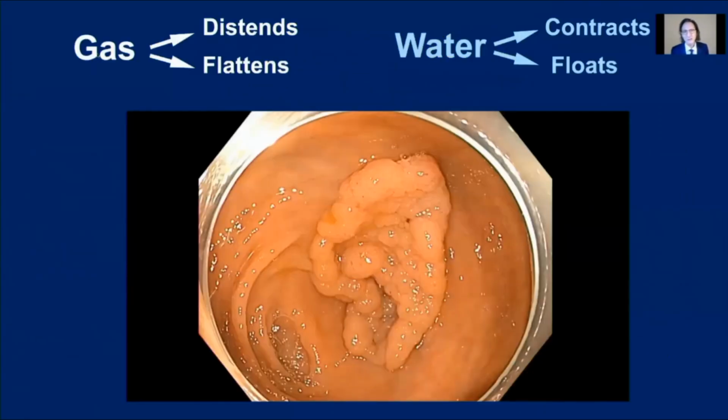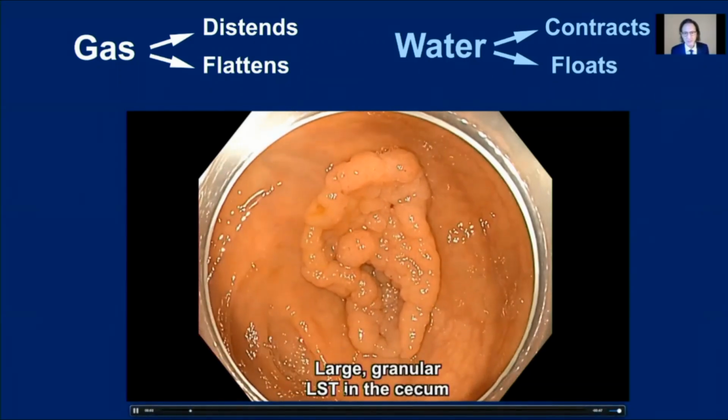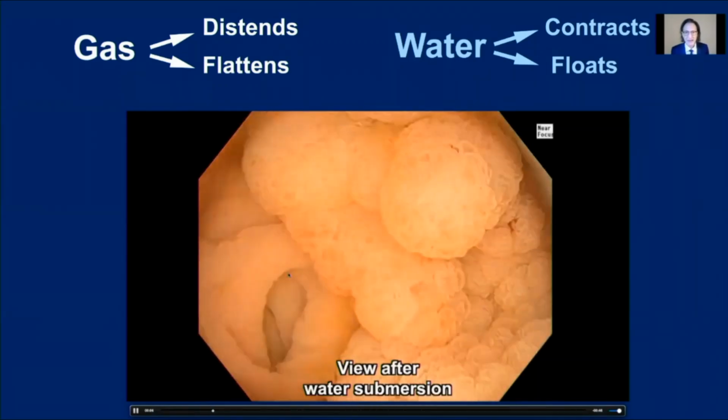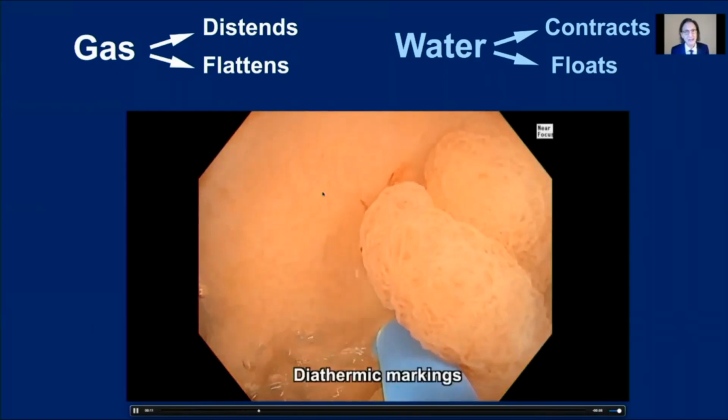So when we insufflate gas, this distends the lumen and it flattens our lesion. But when we use water, it does just the opposite. It contracts the lesion because we're not forcibly distending the lumen, and the lesion floats. So this is nicely illustrated for this very large lesion that's perhaps as large as 4 centimeters adjacent to the AO. So it's a granular type LST, and here's the appearance underwater. So you can already see that floating effect and the contraction.